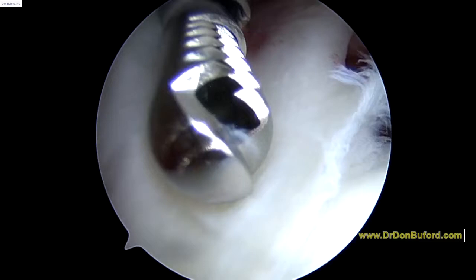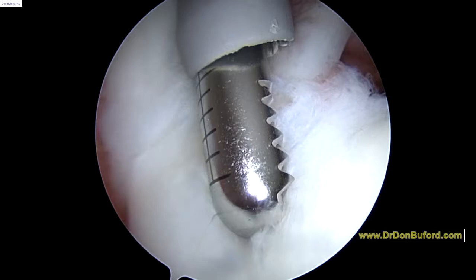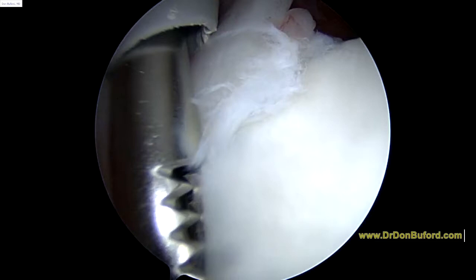So now the trick here to fix these properly is to get right down in front. Now we've got to remove some of the cartilage here.